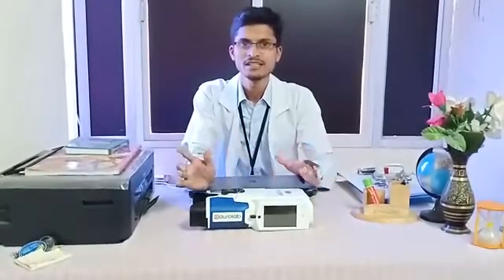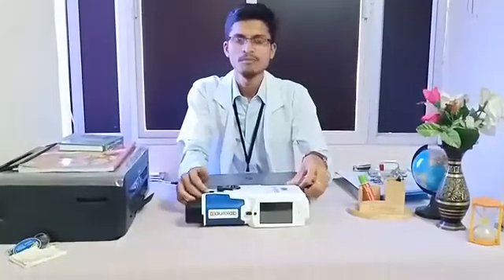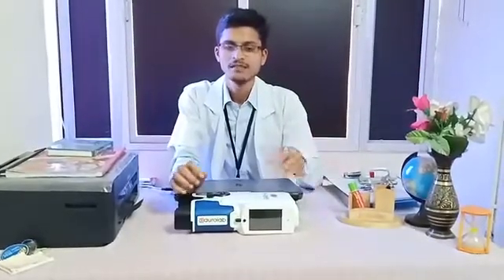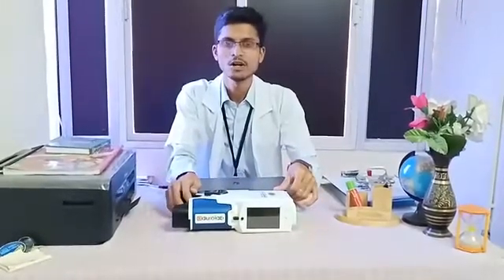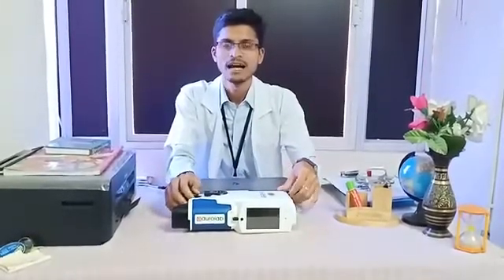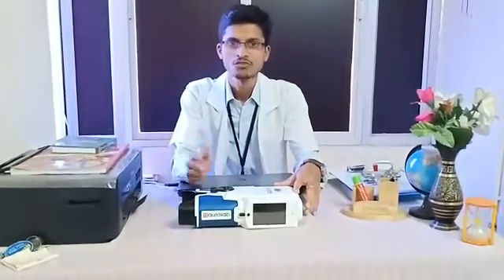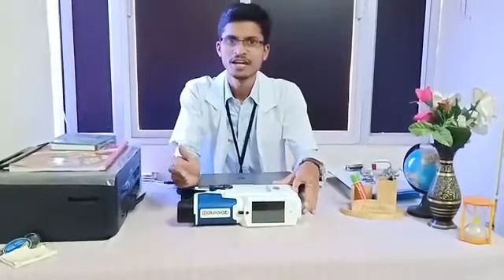More of the pediatric and geriatric population can be covered with this instrument. Comparing the time taken for subjective refraction done with a normal unit versus this handheld device, the time taken is very minimal. Patients also like it a lot — it's handy and can be taken in a suitcase for community outreach and house visits.